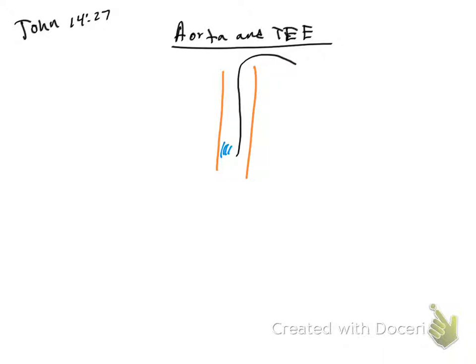Okay, so now we are going to have the same probe, but now it is facing posteriorly. Sorry, I shouldn't erase that one, I mean the wrong one. Here we go. So now we are posteriorly. Which structure can you visualize posteriorly? You can visualize your aorta. Okay, this is your aorta.